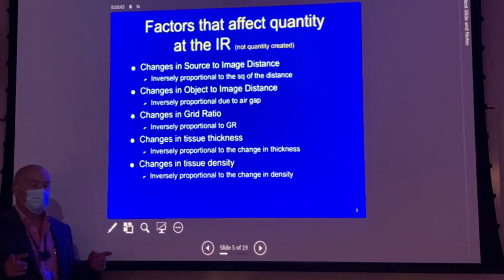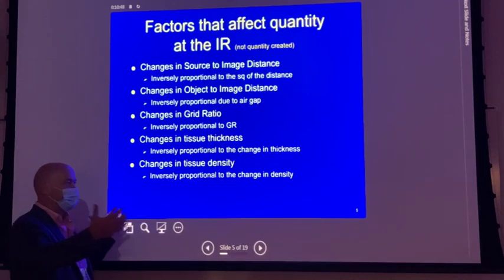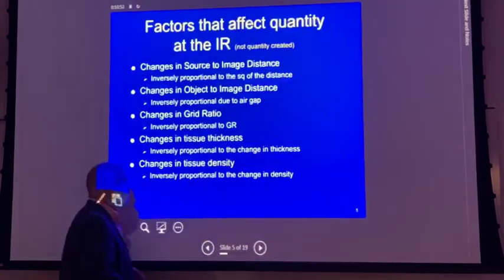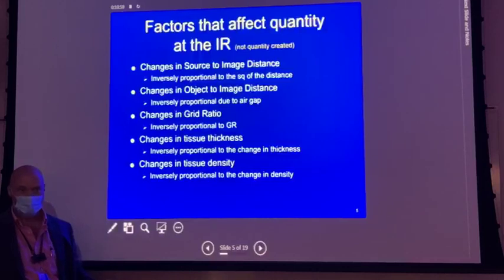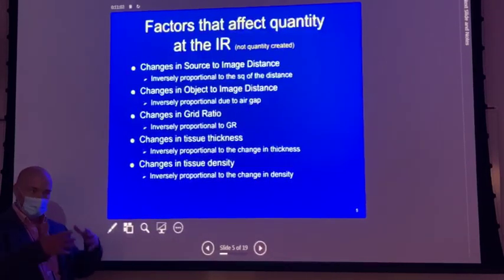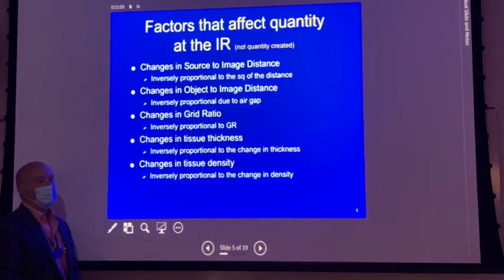But the problem is that as they cover up the entire wall, the light that is projected right here would be spread out more so. So what would happen to the brightness? What would happen to this blue coloration? It would go down. It decreases, right. So everything would decrease because that quantity of light has to spread out over a larger area, right?